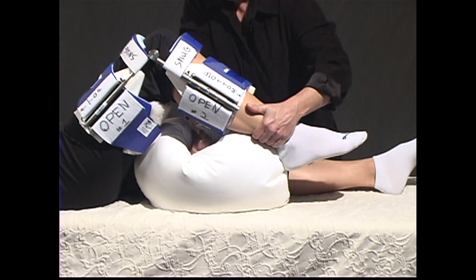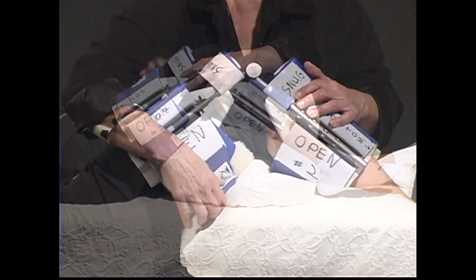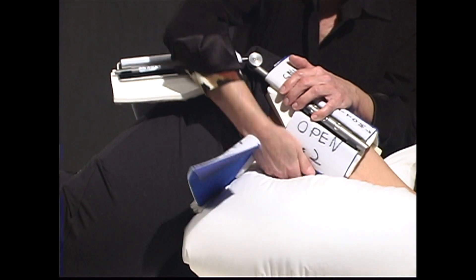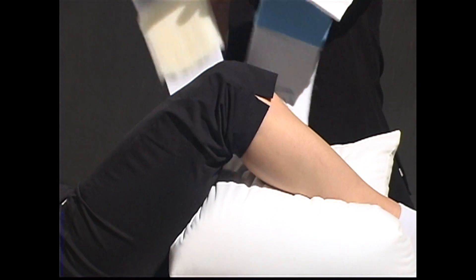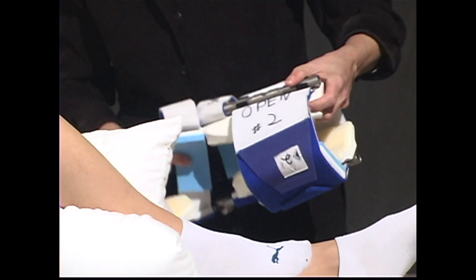Arrange a pillow under the patient's calf so that the heel is floating. To remove your knee extension DynaSplint, simply open the back of the thigh cuff and the back of the calf cuff. Gently remove the splint from the patient's leg. Please close the cuffs while the splint is not being worn.